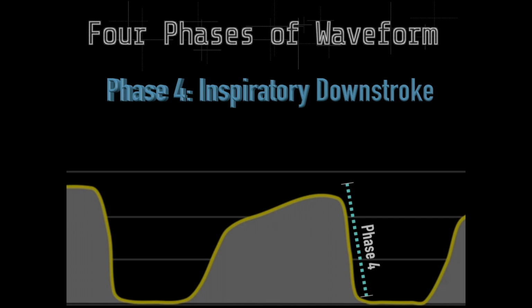Remember, while assessing the 4 stages of the waveform, the CO2 concentration should always start at 0 and always return to 0 with each breath. If you're not observing this, you must assess and determine why, because something may not be right.